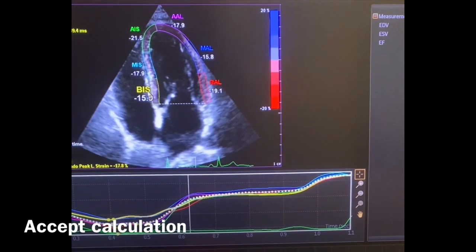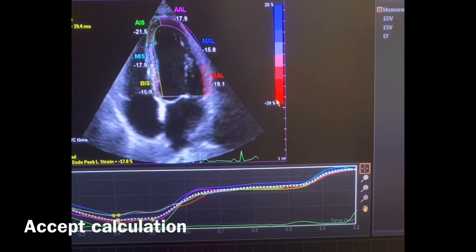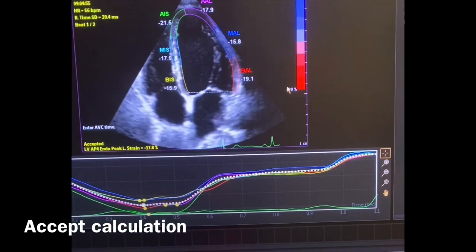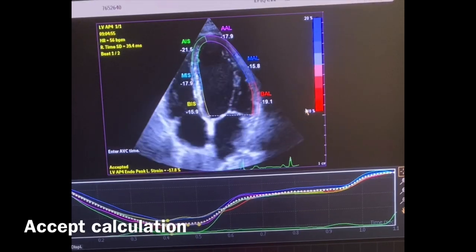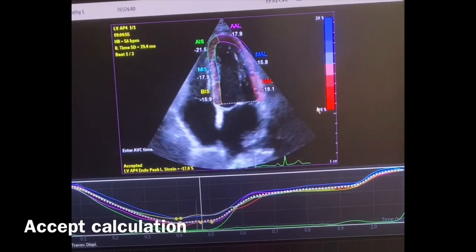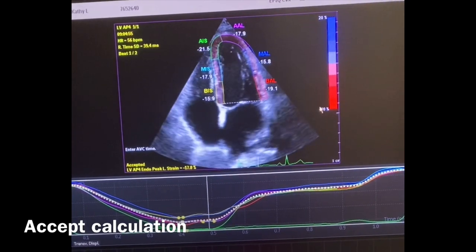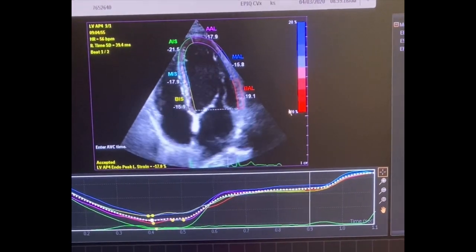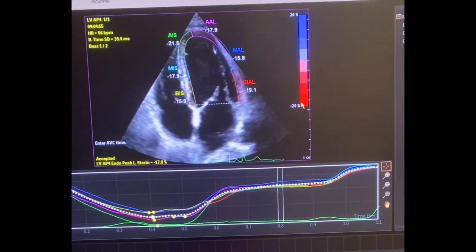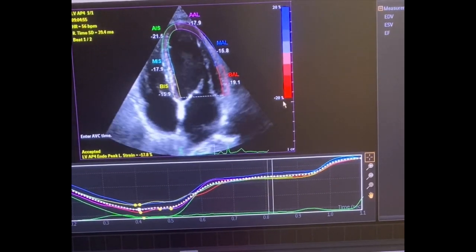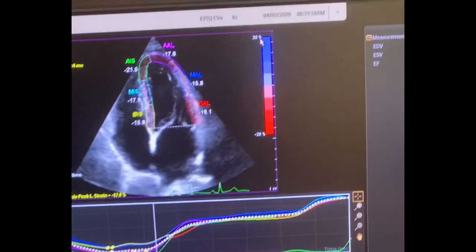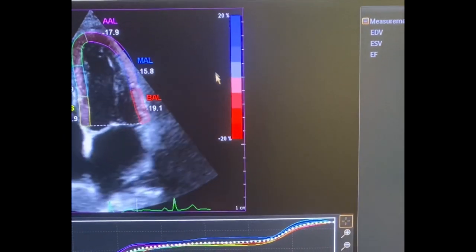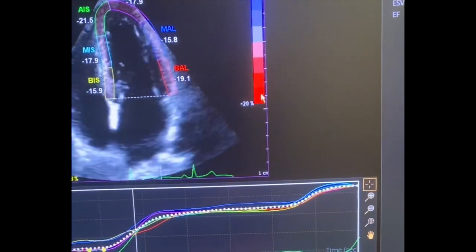These negative numbers here reflect this color scale. The closer it is to negative 20 — remember absolute value: to the left of the scale was positive, to the right was negative. Absolute value goes 0, negative 1, negative 2, negative 3, negative 4. Moving towards a more negative position is actually normal for strain; moving towards a positive position is actually abnormal. Negative 20% is darker red and more normal strain.